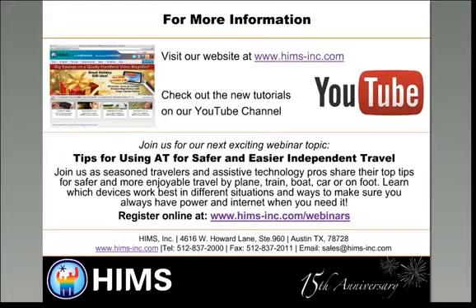front is simplified so that you have the three buttons to access radio, music, and books, and the button at the bottom for OCR. And then instead of the numbered keypad, you have a sort of compass rows of buttons. You have an up, a down, a left, a right, and a select. And so it's very, very easy to use that way.